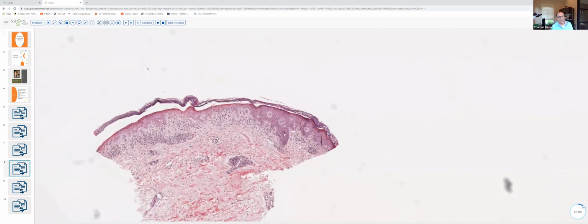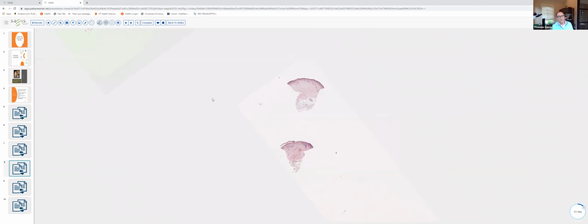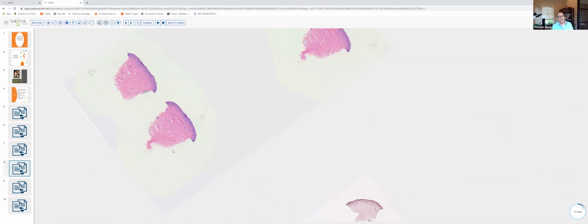So this is erythema multiforme. Again, distinguishing these two, there's a lot of histologic overlap. They both have vacuolar change. They both can have a basket weave cornified layer. They both have necrotic keratinocytes within the epidermis, but within the dermis, in erythema multiforme, we see a superficial perivascular infiltrate of lymphocytes, and with fixed drug eruption, the infiltrate is going to be mixed, containing lymphocytes, frequently eosinophils, neutrophils, and melanophages as well. So hopefully that will help you out there.